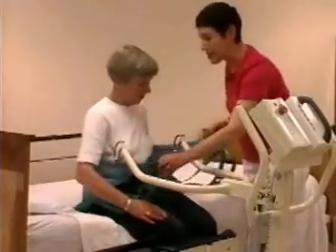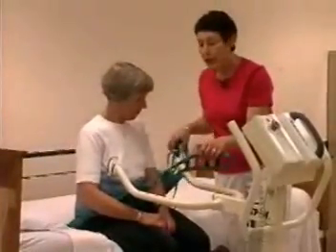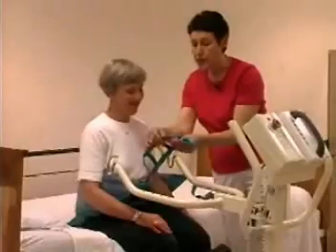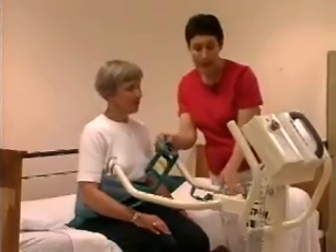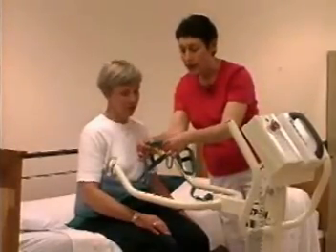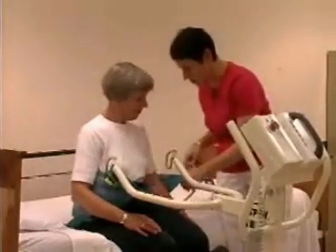Now I'm going to place the ends of the sling into the loop holders. What I want to do is put them through the loops that will allow me to have Mrs. Johnson as close or as far away from the lift as she needs to be. I'm going to choose the yellow and purple loops to put this through.